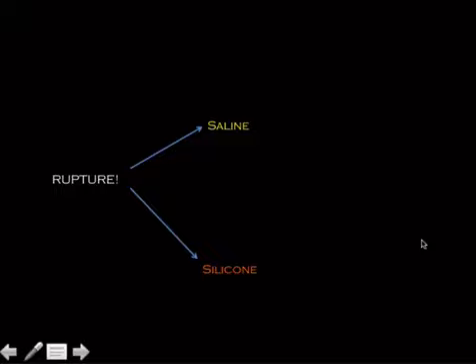So here would be the algorithm, and this would make a good next step kind of question. Patient has saline implants. They could even do a link type question by first showing you that the patient has a saline implant and making you figure it out by being able to see that you can see through it. And then they could say, well, they're suspecting rupture. What do you do? So it depends on what your choices are. The wrong answer is MRI, and the wrong answer would be ultrasound. The wrong answer would be PET or nuclear medicine or anything like that.